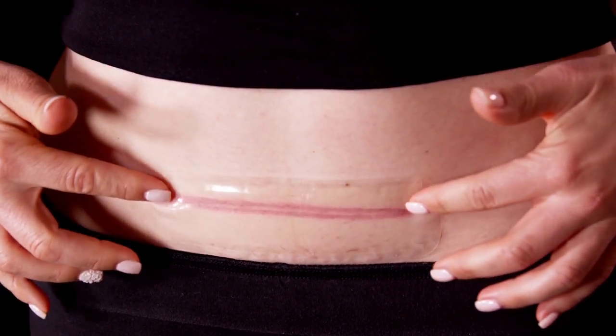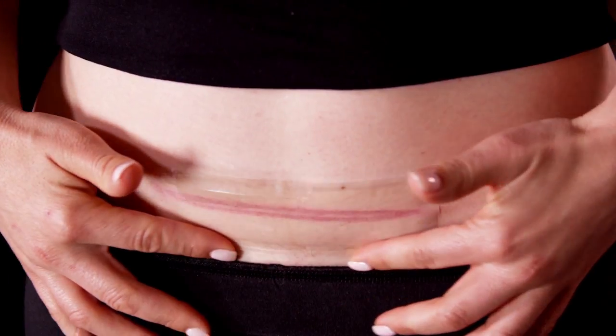If any air pockets occur, smooth them out and make sure the dressing is evenly adhered to your skin.